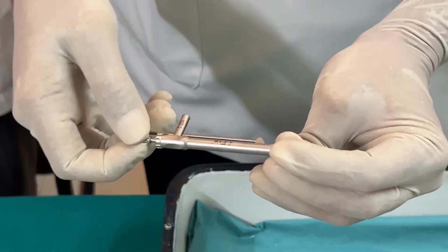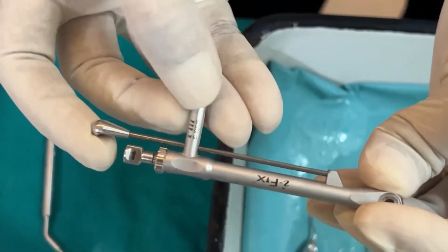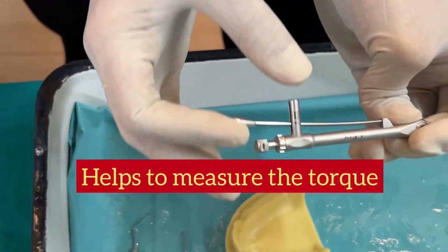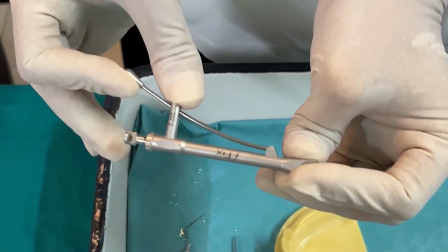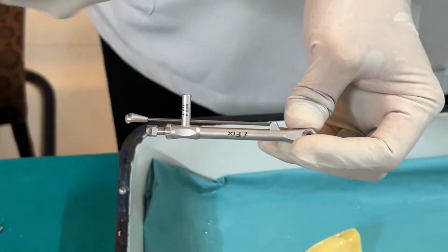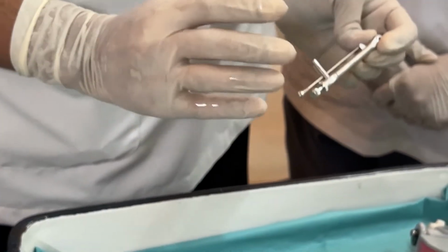So I'll demonstrate both. And what's the purpose of this pin then? This pin has these markings written here, 15, 20, 30, 35, etc. These are the torque markings. So you can measure the torque in between, that at what force are you tightening your implant in the osteotomy. The moment excessive torque is there, that basically means what? You are actually crushing the bone in the osteotomy, on the periphery of the osteotomy. So the chances of failure of the implant increase. That means somewhere your osteotomy was too narrow, you might have to widen it up.